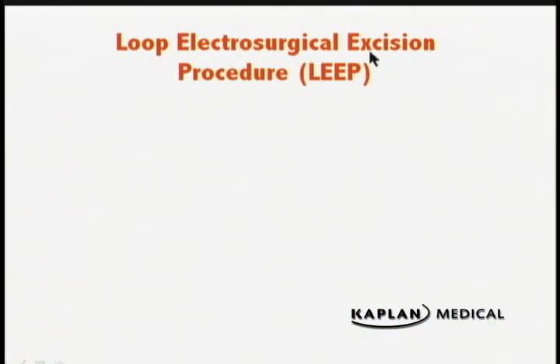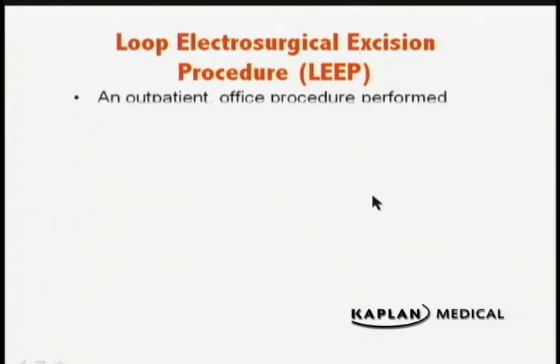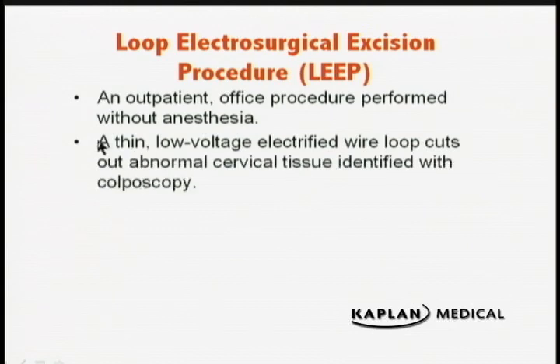LEEP. LEEP stands for Loop Electrosurgical Excision Procedure. This is done in association with colposcopy. An outpatient office procedure, not in the operating room, in the office, performed without anesthesia.